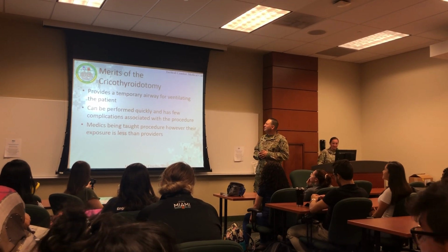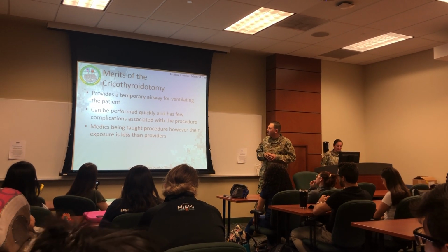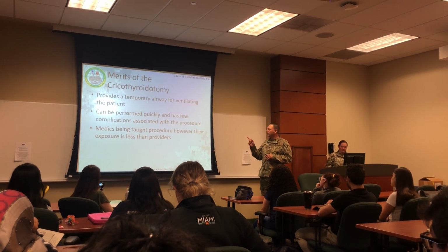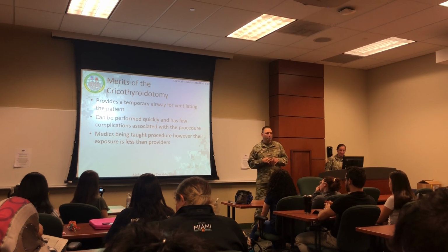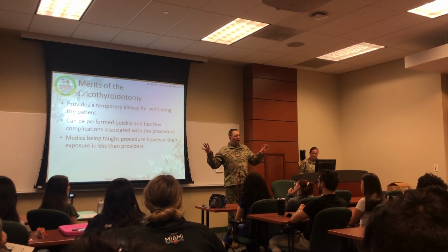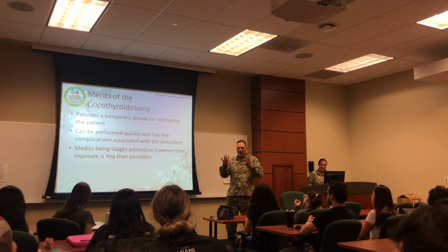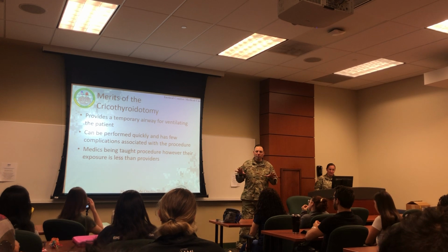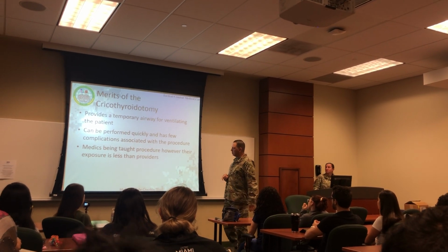All right, so right here you can see merits of cricothyroidotomy. Okay, it provides a temporary airway for ventilating the patient, can be performed quickly, and has few complications associated with the procedure. This is not a sterile procedure. Ideally, in a perfect world, it would be conducted in a sterile area, surgical room, all that, but in reality, it does not have to be a sterile procedure.